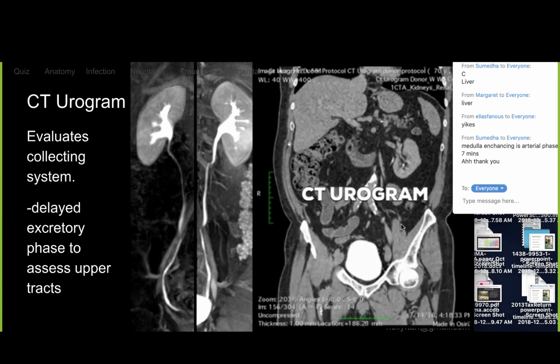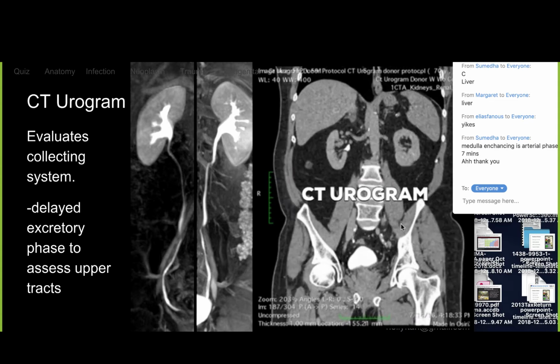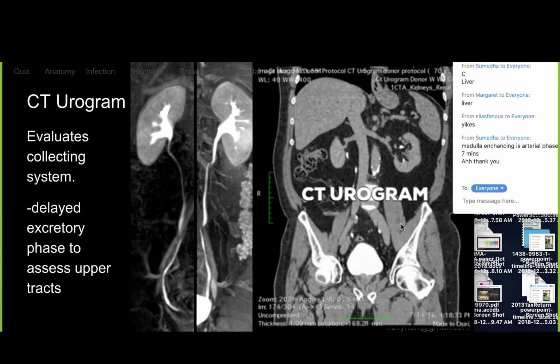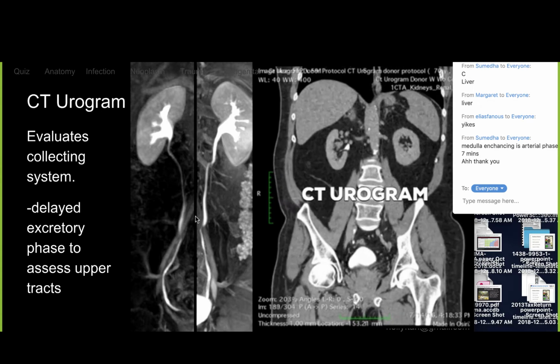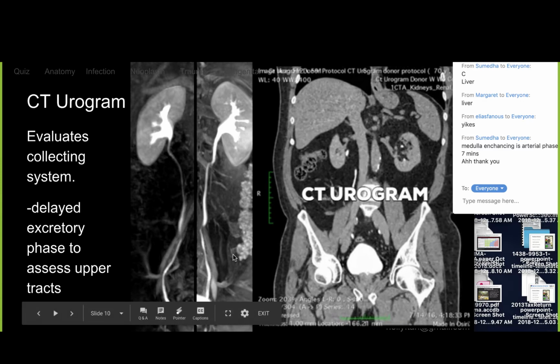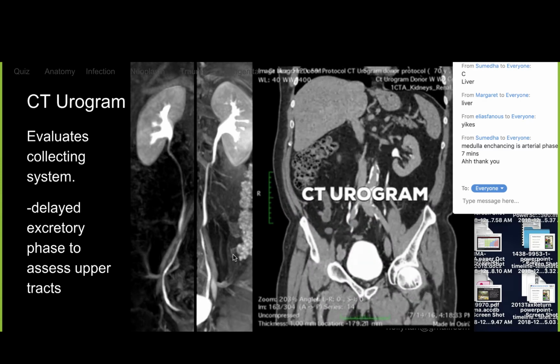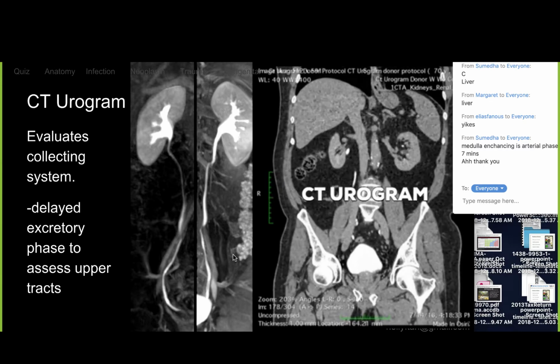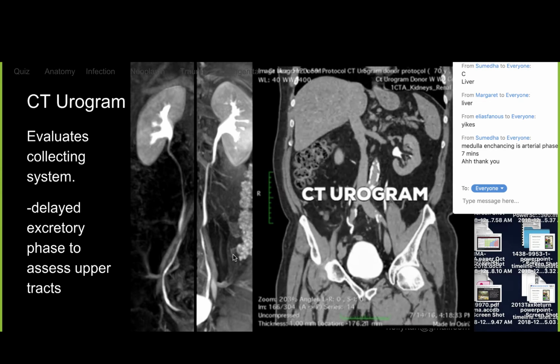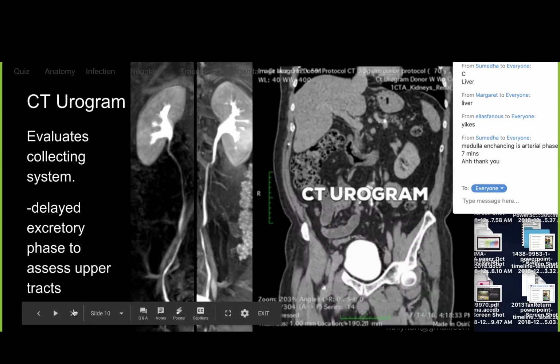MRI takes a little longer. CT is very fast. Acquisition is like seconds. MRI takes anywhere from 20 to 30 minutes. But in terms of image quality, you just get far superior image quality with MRI over CT. So you have to take both into consideration and then decide what's best. If you're ever concerned about what you should do, you can reference the ACR, American College of Radiology Appropriateness Criteria, and they have recommendations specific to the clinical context.